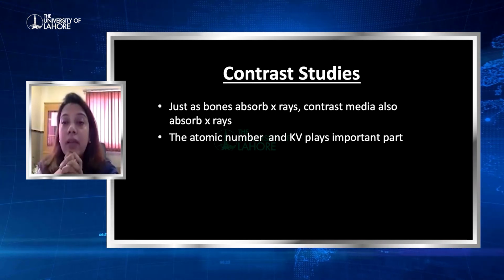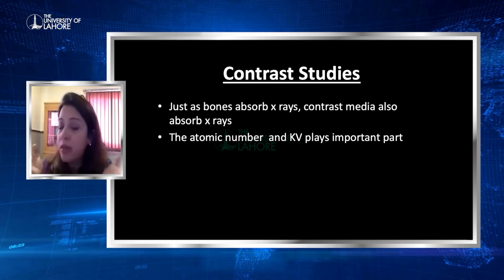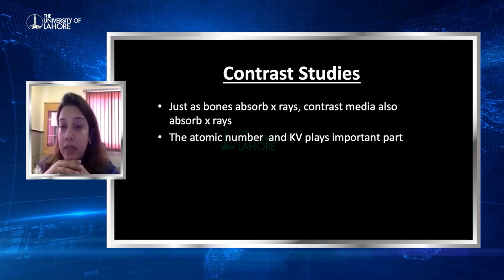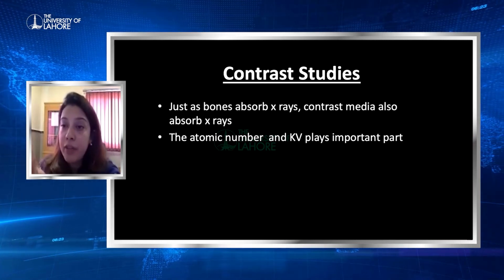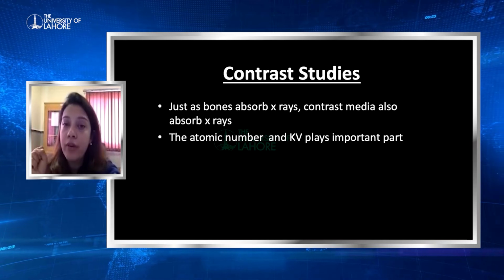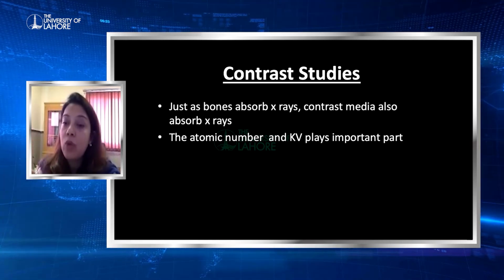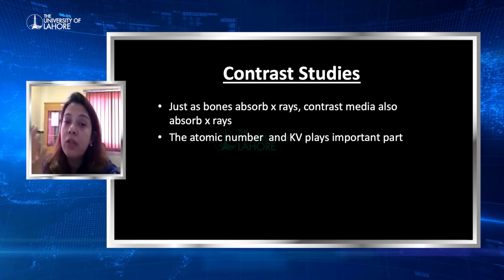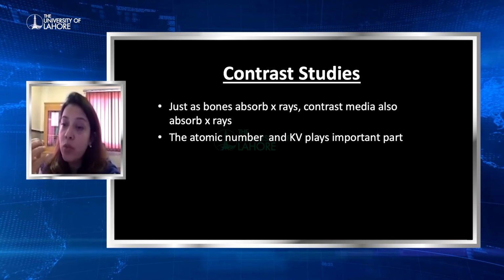So the contrast studies are basically fluoroscopy. The machine is almost the same, the principle is the same. It is basically utilizing X-rays, but you are giving the patient some contrast, oral contrast, right? And as bones have a high atomic number and absorb more X-rays, similarly, the contrast also has a high atomic number. It also absorbs the X-ray, so it would appear white.